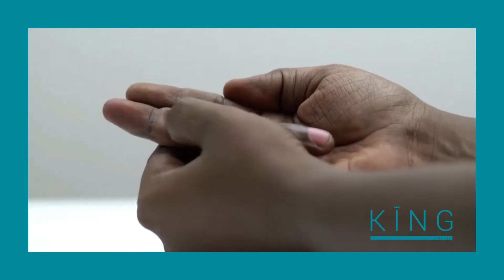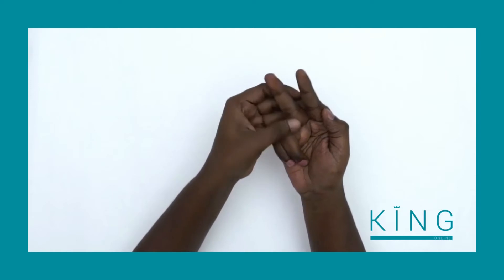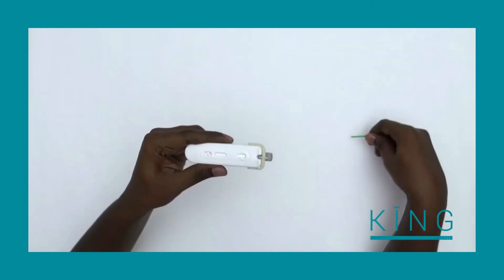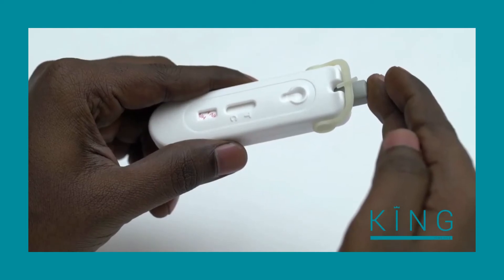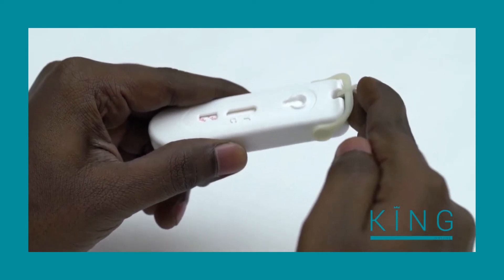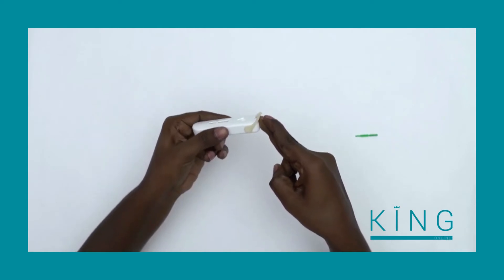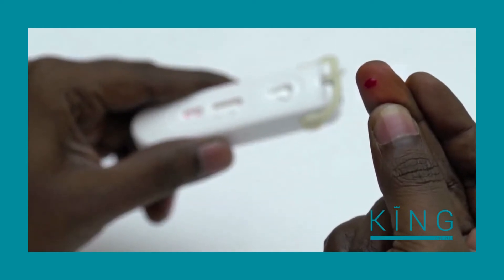Select a finger and firmly massage it for five to ten seconds to get the blood flowing. To remove the green tab, gently turn it, then take it out and discard it. The grey button is used to prick your finger and can only be used once. Firmly push the grey button in to prick your finger. To most people, the prick feels like a rubber band snap against the skin.